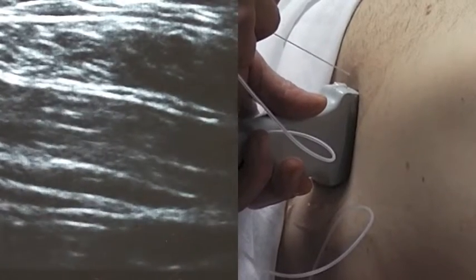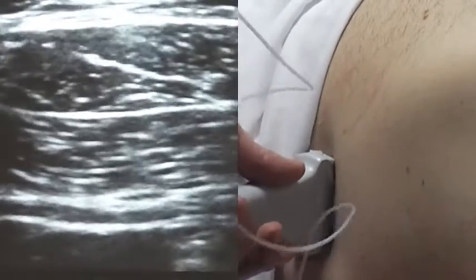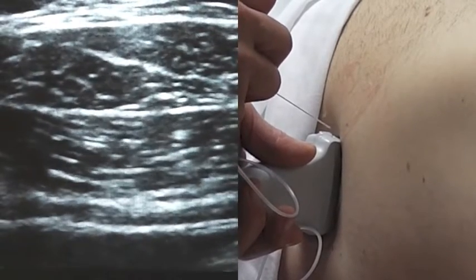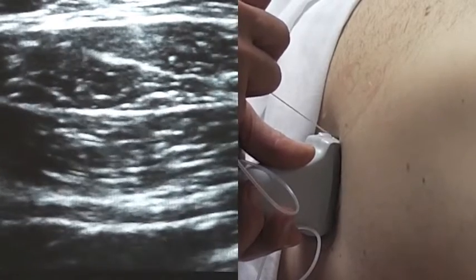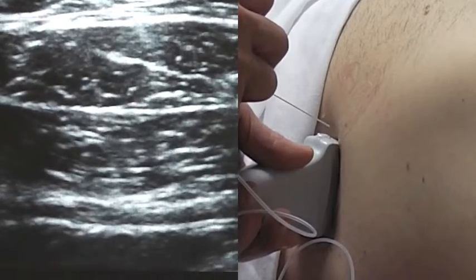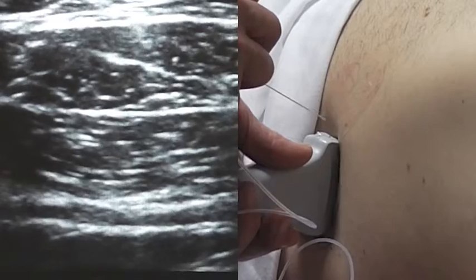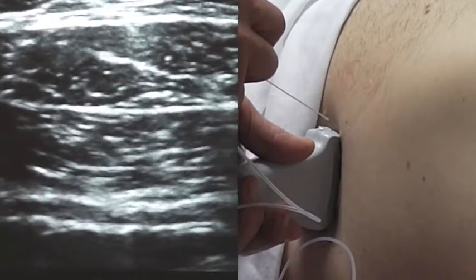If I'm doing catheters for a Caesarean section or an open case, I try to place my probe as lateral as possible so that I'm as far out of the surgeon's field as I can be. After the catheter is placed, we'll secure it with Tegaderm and tape the catheters as lateral as possible to try to maintain a sterile field for the surgeons. We typically do this block at the beginning of the operation, but doing it at the end gives you the freedom to place the catheter a little more medially or in a subcostal location.